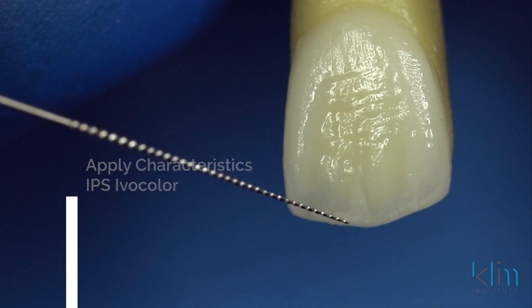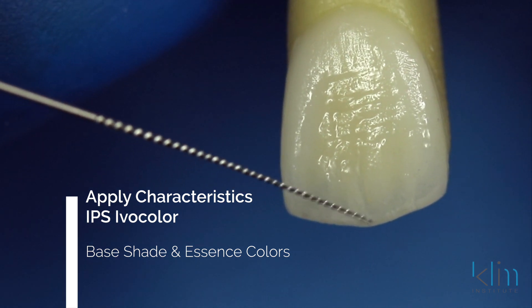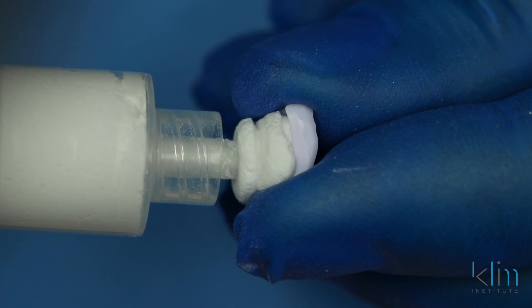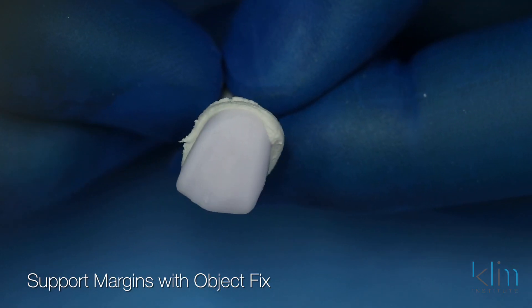For anterior restorations, I prefer to fire them and crystallize them first before adding any characterization. In many cases I may only place characterization on the incisal edge and polish the rest of the restoration. Using thin margins, you're relying on the shine-through of the tooth from underneath — that's the beauty of this technique. So in this case, what we're going to do is fire the restoration with just object fix, no glaze on it, and then come back and finish those margins and add our characteristics.